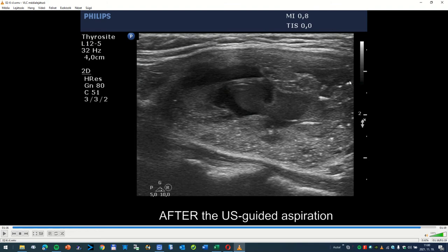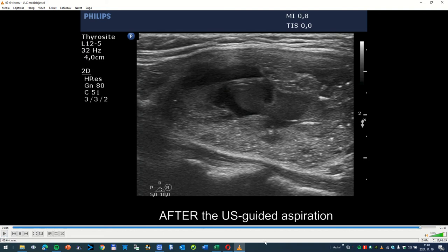Returning to our topic: echogenic granules or lines — here there is a tiny cystic area. Here it is not evident whether this is located just dorsal to cystic areas. Regarding these figures, most lack a ventral cystic area. Nevertheless, it is a reasonable assumption that these are also located dorsal to cystic areas, but such tiny cystic areas cannot be resolved in the ultrasound video. This part of the nodule should be aspirated. This is the form of the backwall figure which is not clearly distinct from a micro-calcification. This was our second case.